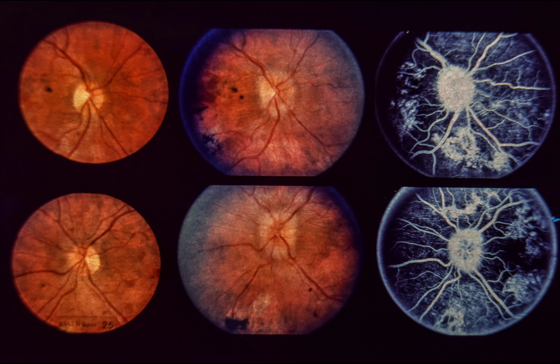A diagnosis of acute posterior multifocal placoid pigment epitheliopathy was made. The patient's visual acuity gradually improved on systemic steroids. 3 years later, he again noted reduced vision in his right eye. Visual acuity was 20/30 right eye and 20/20 left eye. Upper center and lower center. Both optic discs are now hyperemic and edematous, but no hemorrhages or exudates are seen.